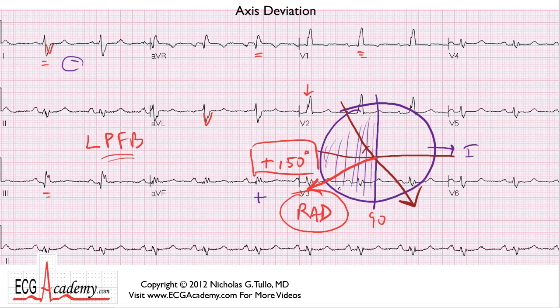I'll also introduce the idea of anatomical correlates to different ECG leads so we can nail down the anatomical regions that we refer to, such as the lateral leads and the anteroseptal leads and the inferior leads as we go on and start talking about ST segment abnormalities and other regional myocardial problems.